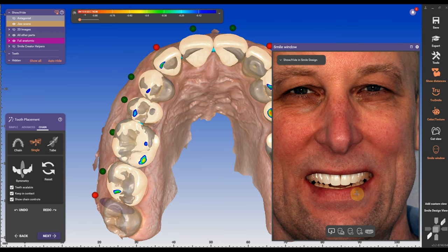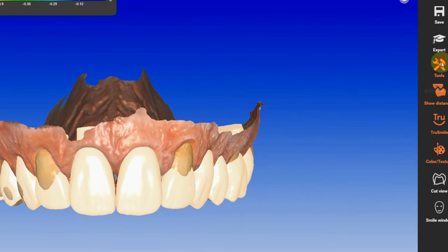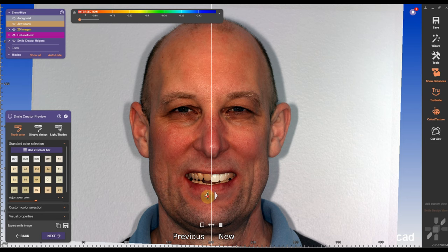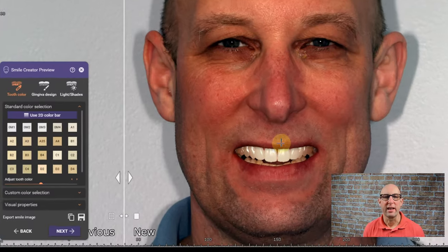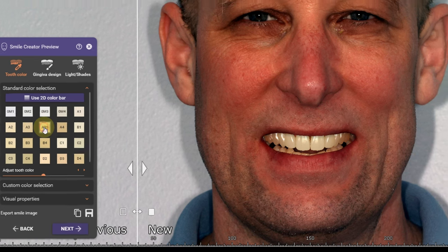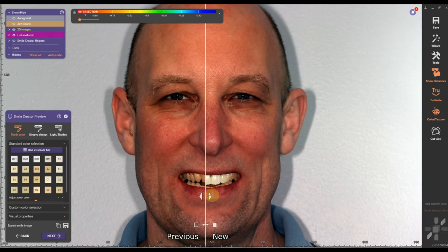Then under tools, I can go back into the actual smile creator. In the smile creator, I have my preview before and after again. I can change shades — for example, I'm starting out with an A1, I can have an A2, A3, A3.5. So you can see right away how you're gonna look with a different shade.